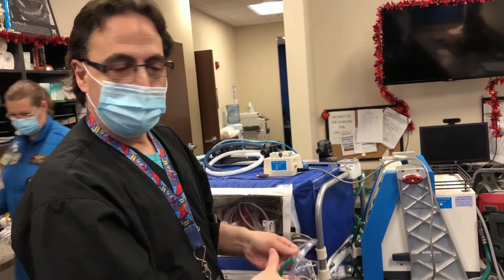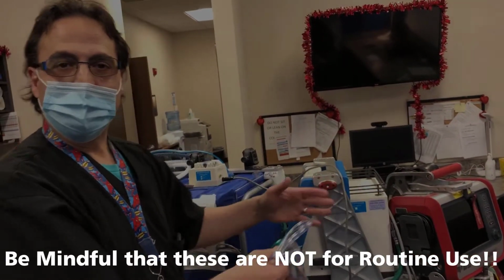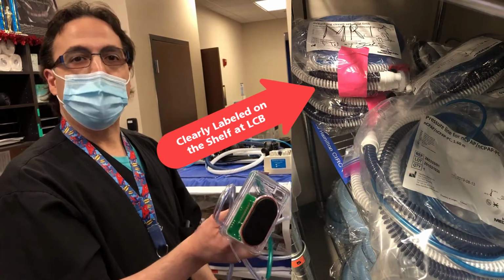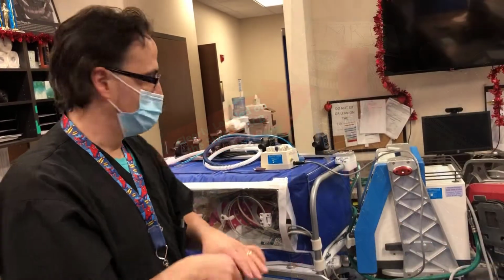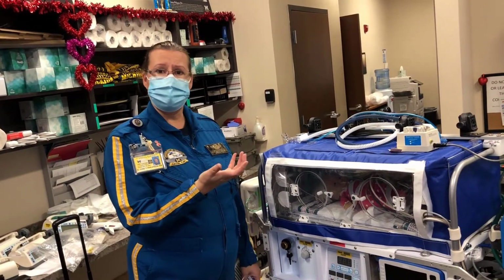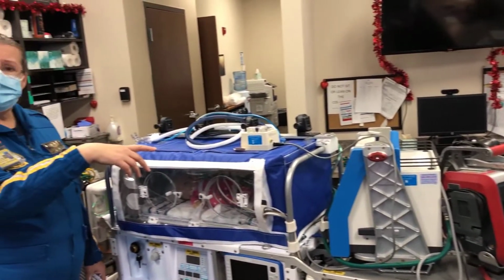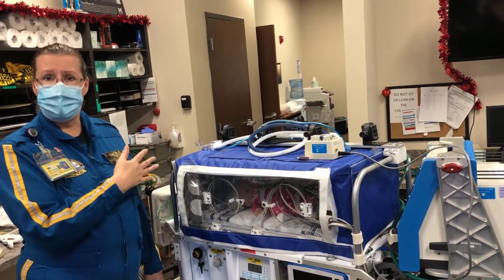The other thing too we will be doing with this configuration, we are going to be bringing an MRI Hamilton circuit with us to give us that additional length of circuit that will make it easier to get around the Isolette. Survival Flight will have some here, but we will also be bringing one just in case, and also to switch out from the one that they set up on the Hamilton for us. So while we're waiting for RT to arrive, one of the things Survival Flight can do is switch out the exhalation valve, calibrate the vent circuit, and install the MRI circuit, so that's one less thing we have to calibrate once they get here with everything else.